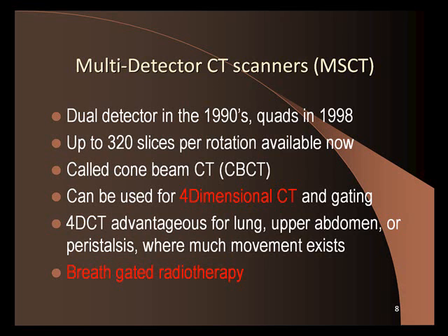So it could be 1 to 5 millimeter. Okay? But now with cone beam, what they're doing is they're extending this into the board, so you can acquire a larger area, like 1 foot or 2 feet wide in this direction, into the board direction. Okay, and that's called a cone.